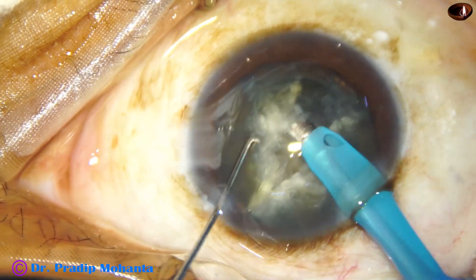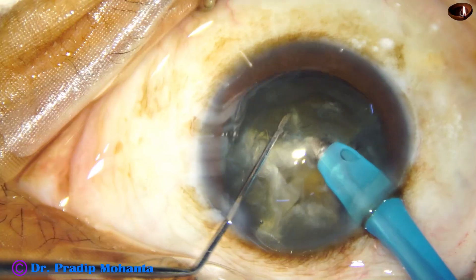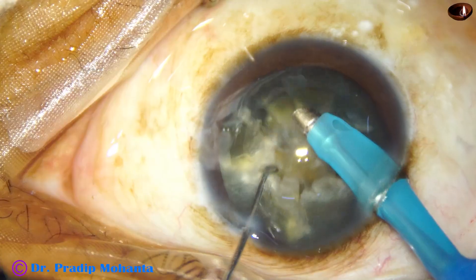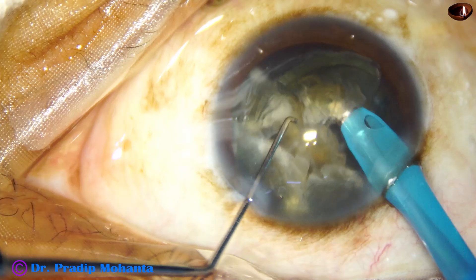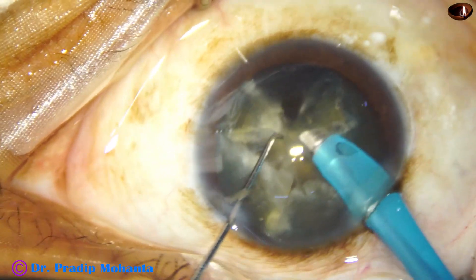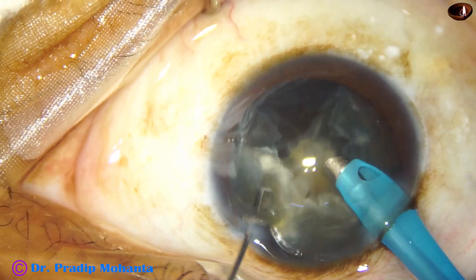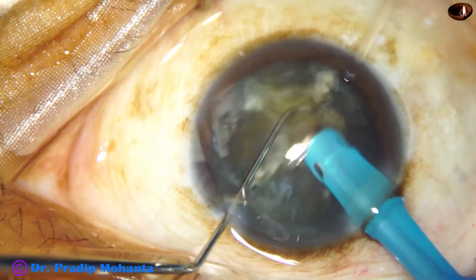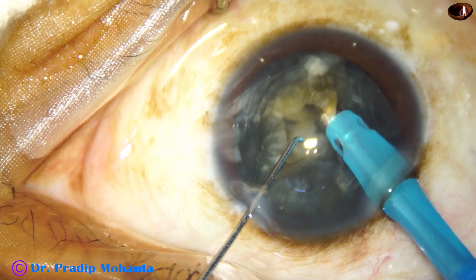I've got a free nuclear piece and I emulsify this, rotate, hold this piece, crack and try to emulsify this small piece. But the endonucleus is resisting its forward movement. Ultimately it came around the endonucleus. The ultrasonic power being used is 80%. Flow rate is 48 ml per minute. Vacuum is 480 mmHg.